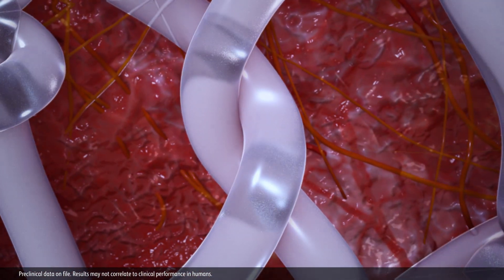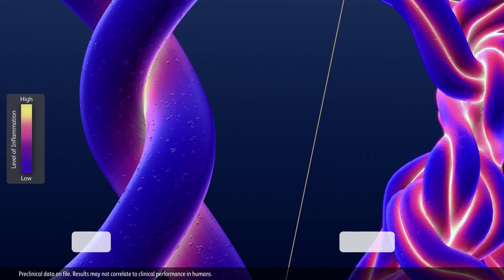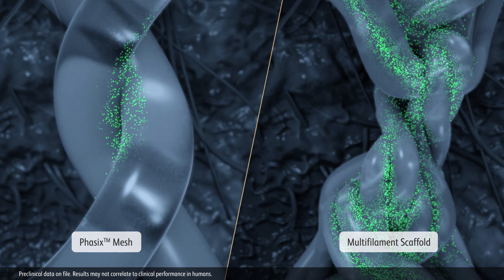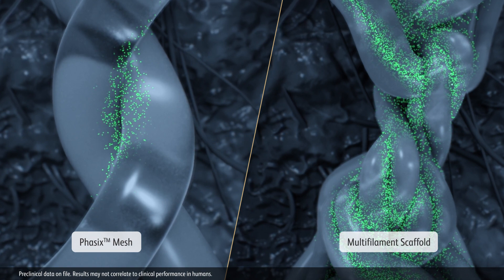As Phasix is resorbed, studies have demonstrated minimal inflammation. In comparison, conventional multifilament scaffolds have a more complex structure and greater surface area, which can shield bacteria from antibiotic treatment and host inflammatory responses.